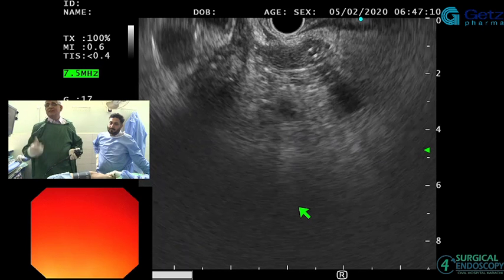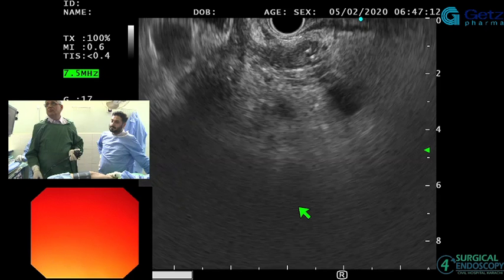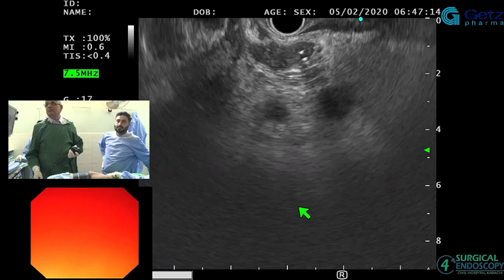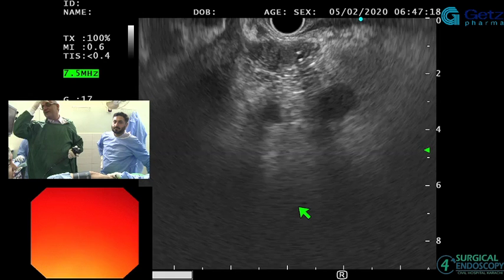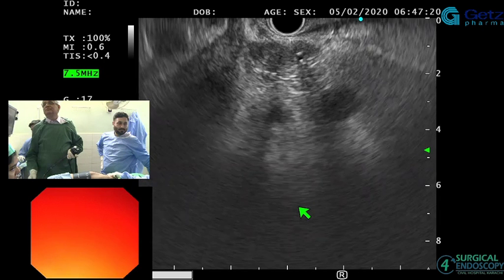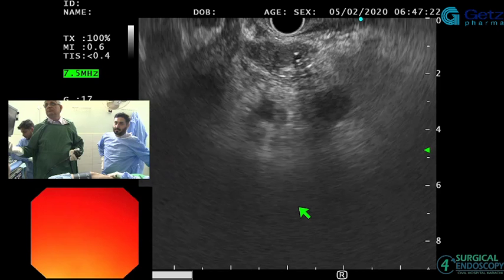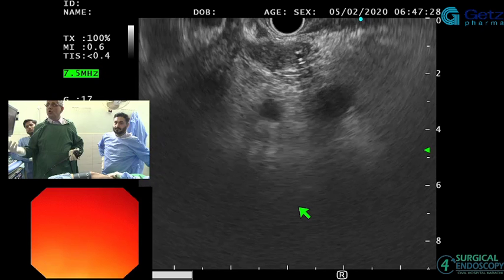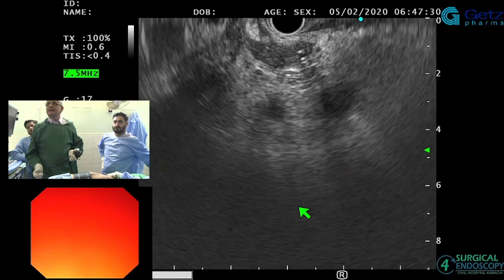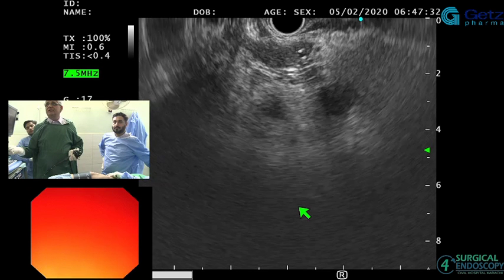Any other mets, CT scan would pick up better than us, because we can only look at the left lobe and segment 5, so we can't look at the whole liver and can't look at anything beyond 5 centimeters generally speaking. So a lot of things are going to be picked up by CT scan that we can't pick up, because CT scan is a more holistic test and has advantages with vascular invasion and vascular involvement.